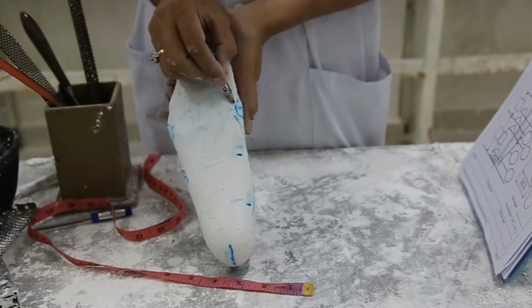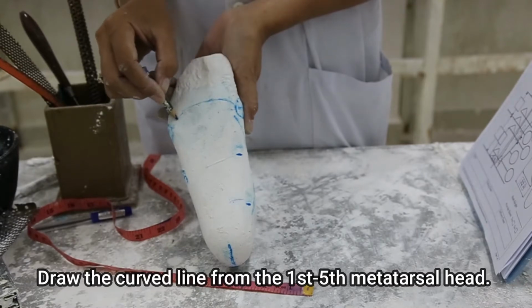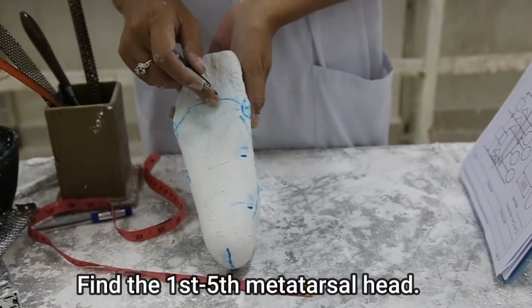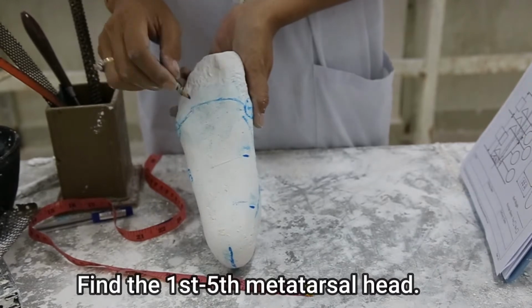So firstly, you need to transfer from the first head to the fifth head, and then find out where is the first head, second head of metatarsal, third, fourth, and fifth.